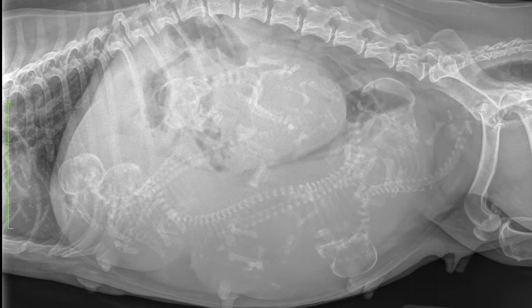Prior to this, in preparation for the big day, the breeder had a puppy count performed using ultrasound, and the total fetal count was 6. Therefore, when they came to you for this radiograph, they were expecting, since 3 puppies have already been born, that there would be 3 left. Let's start by counting skulls and spines on the lateral view.